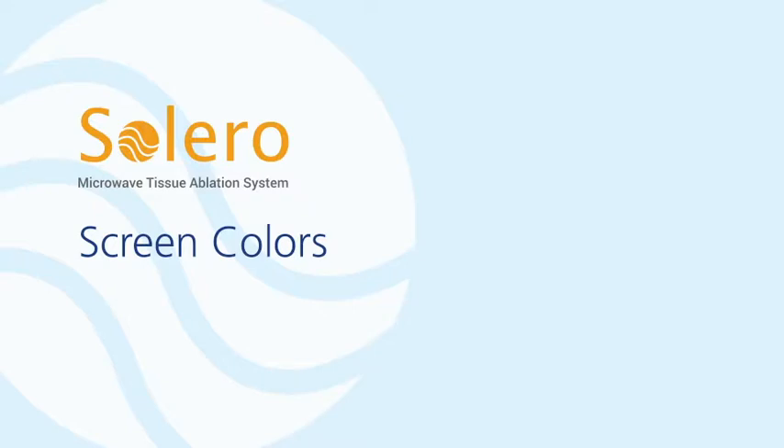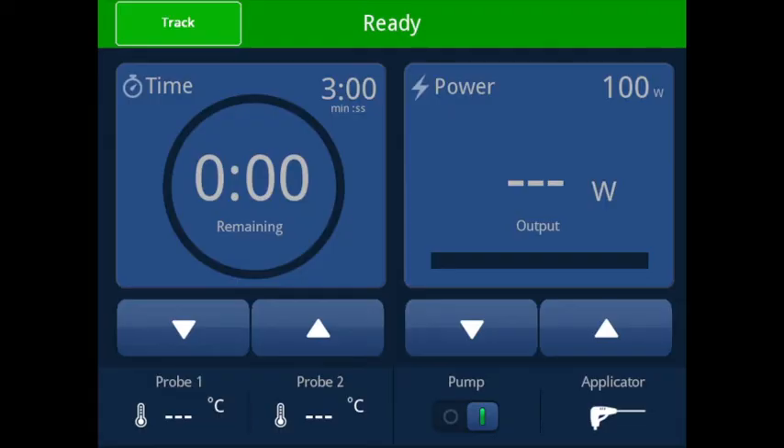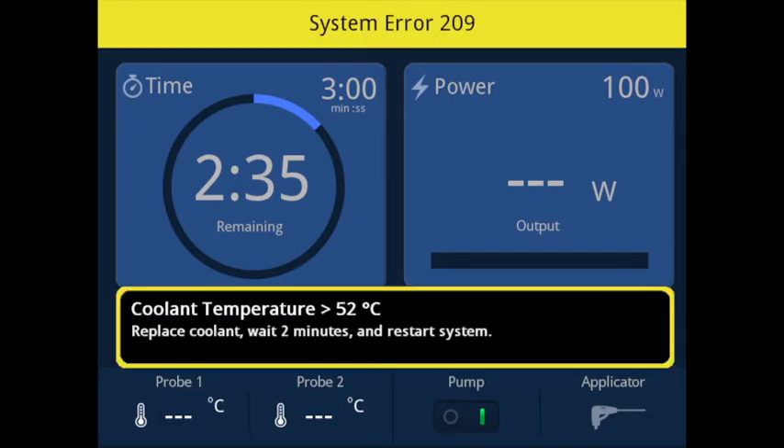Screen colors. The system uses color coding to make the state of the system clear to the user. Green screen borders mean the system is functioning properly and ready to begin an ablation. When the screen status bar is blue, microwave energy is active; the timer will be counting down to zero and the delivered power may decrease as tissue changes occur. The system will display an orange status bar or warning dialog when conditions exist that inhibit microwave delivery, and progress may not continue until the dialog is acknowledged and the underlying condition is corrected. If the screen status bar is yellow, a reboot of the entire system is required.